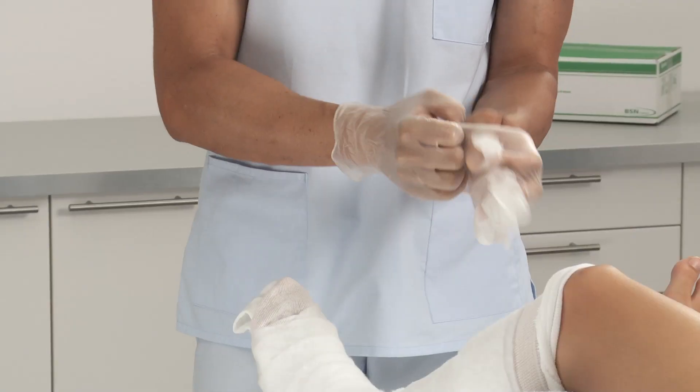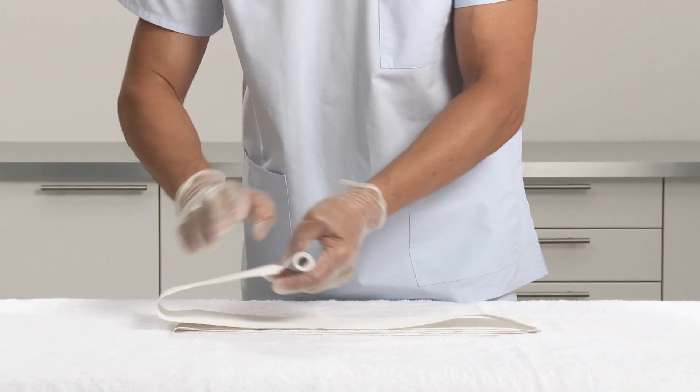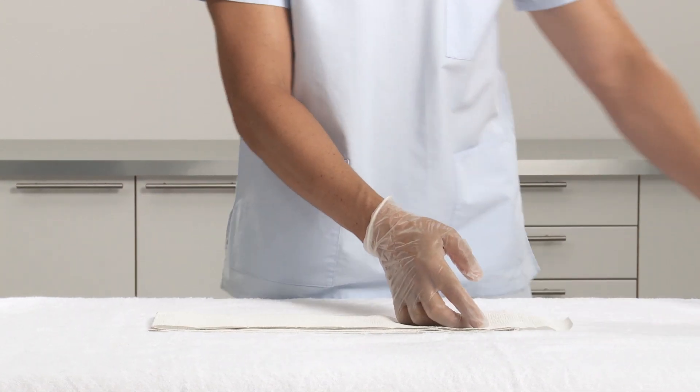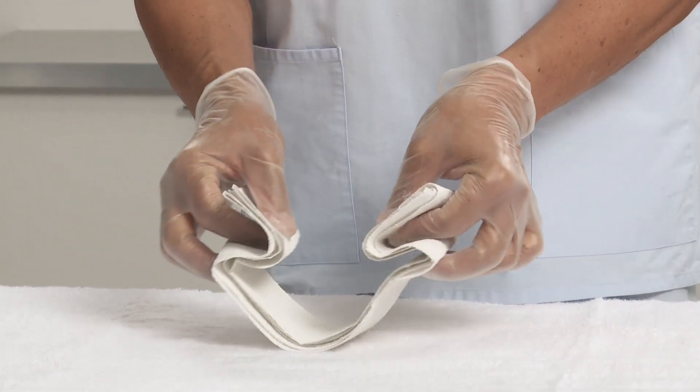It's recommended to wear protective gloves before applying Plaster of Paris. Select the appropriate width of the Plaster of Paris bandage, fold the bandage into six layers at the length needed to fit the patient, and pick up the bandage in a zig-zag shape.